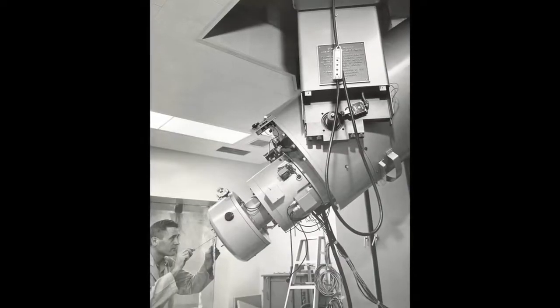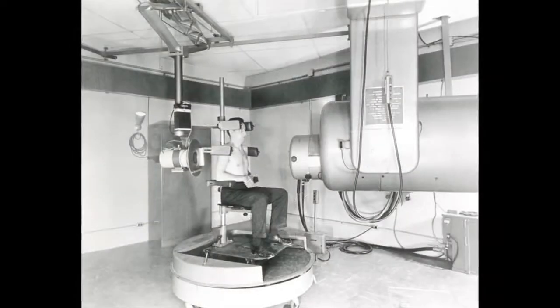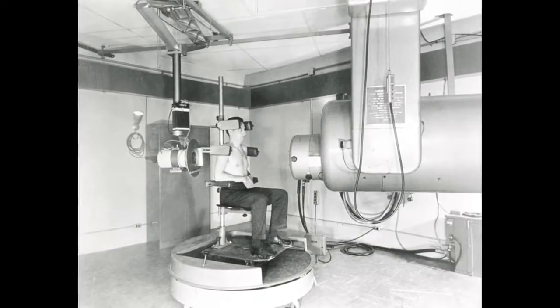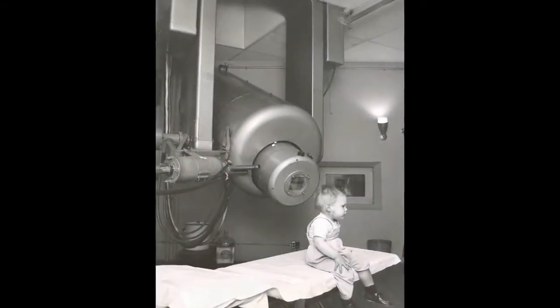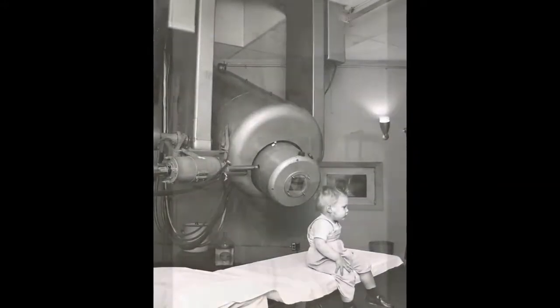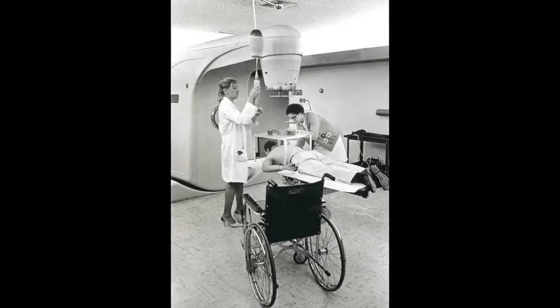Perhaps most lucky of all was the ready proximity of people who knew how to make linear accelerators. The linear accelerator industry is based here in Silicon Valley. And it's an example of Stanford's seminal role in creating modern radiotherapy.